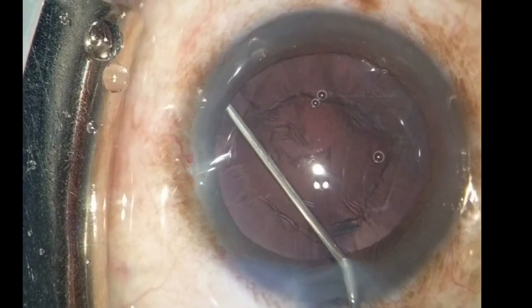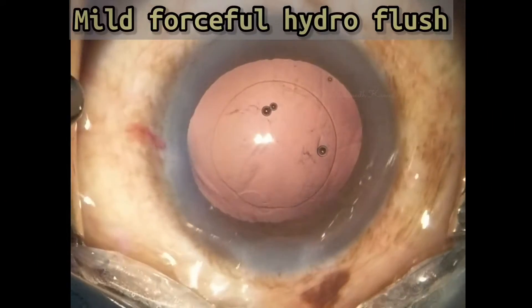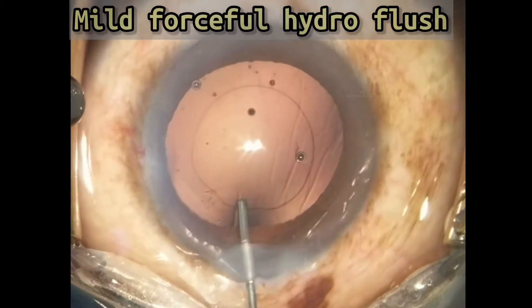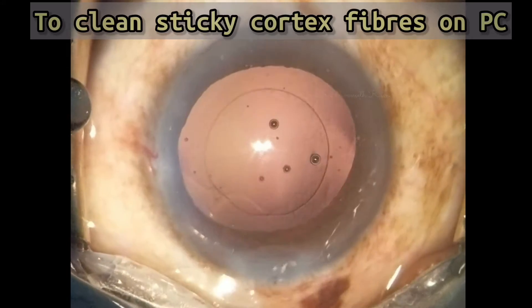Multiple hydros are repeated in all quadrants. During PC polishing, any left-out fine fibers on the posterior capsule can be washed out with a slightly more forceful injection of hydro.